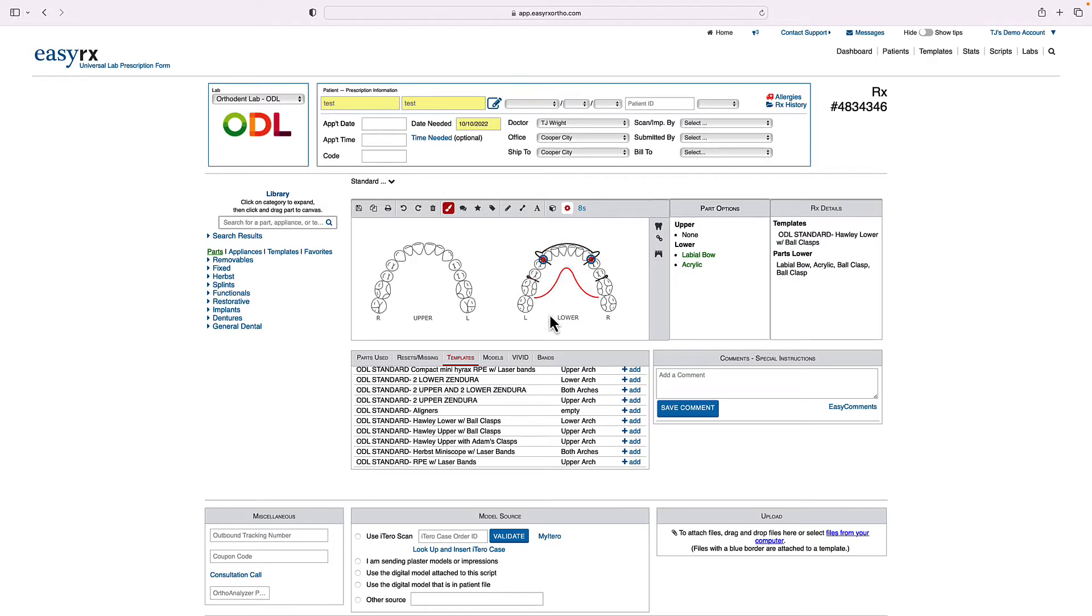So now I can see the parts are on the lower arch. Now, let's say the patient's missing this lower left first molar and I want to move this ball clasp up.